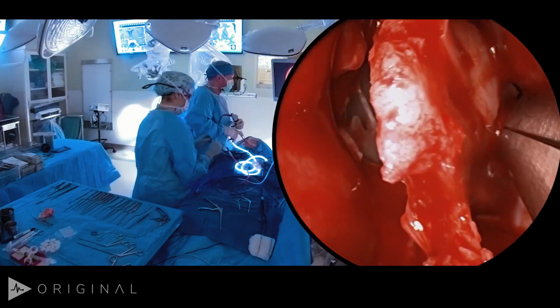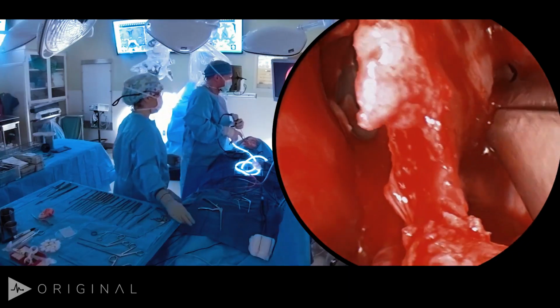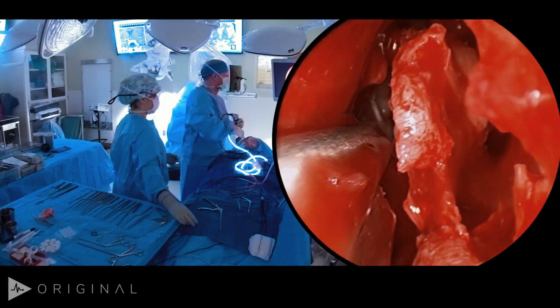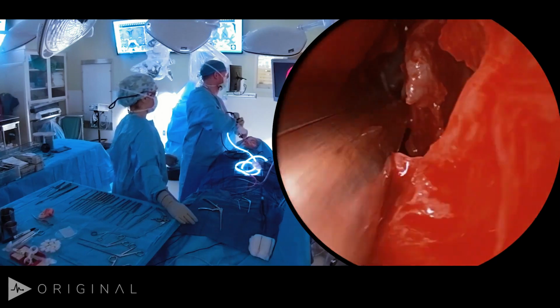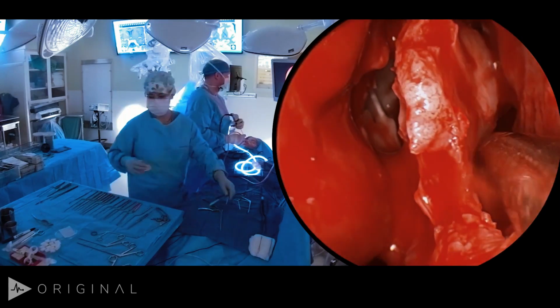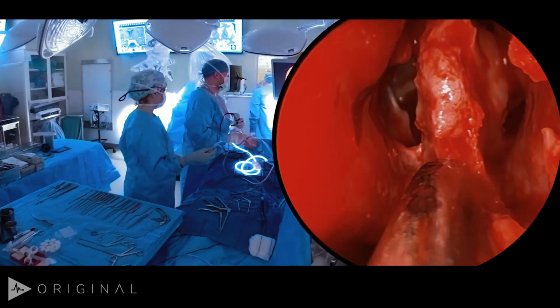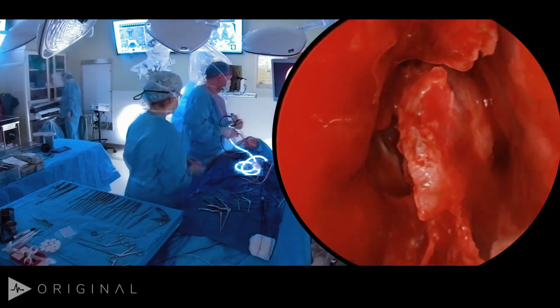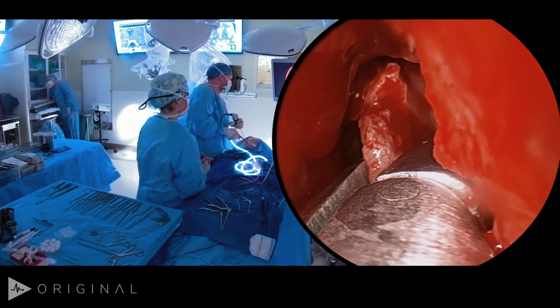So I'm basically on the floor of the sphenoid here. It's hard to get much purchase to get any more bites here. And same on this side. So that's about as low as we can take that. So next, if you feel like you're pretty well freed up top and you've got good down biting cuts, you can take a Ferris Smith and then you want to try to grab this at its base and gently twist it and get it out.